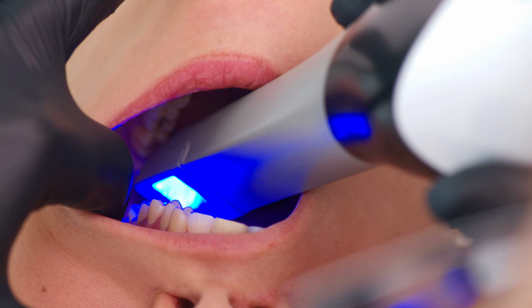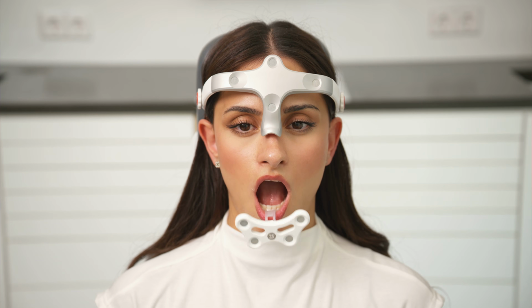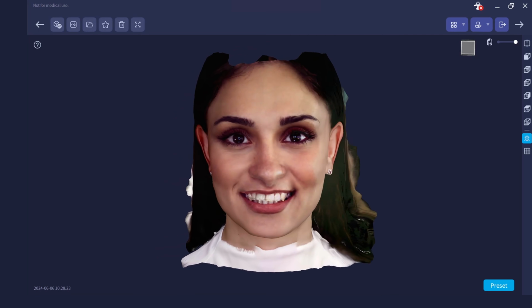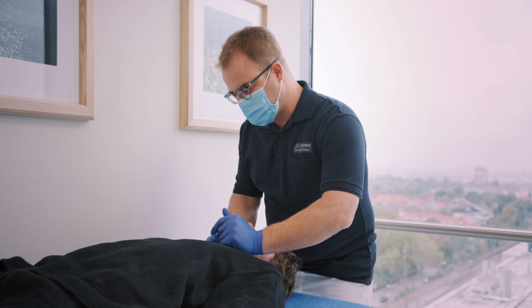This includes an intraoral scan, upper and lower jaw, plus recording the patient's bite in the intercuspal position, and we also perform a comprehensive jaw motion tracking procedure, intra and extraoral photos, and a 3D face scan. And if our initial TMJ assessment shows signs of a potential temporomandibular disorder, there will be a more enhanced examination with a holistic approach, including the complete body of the patient.